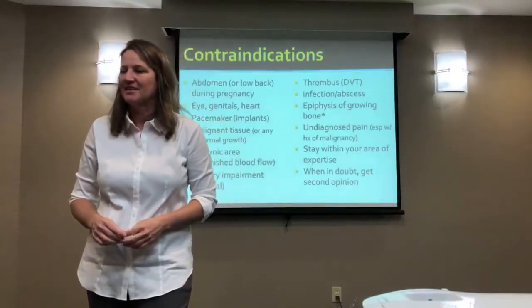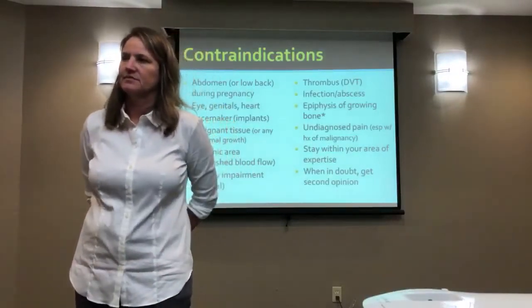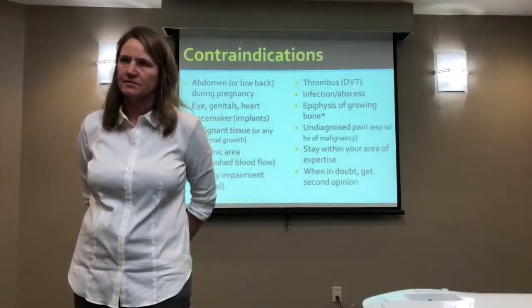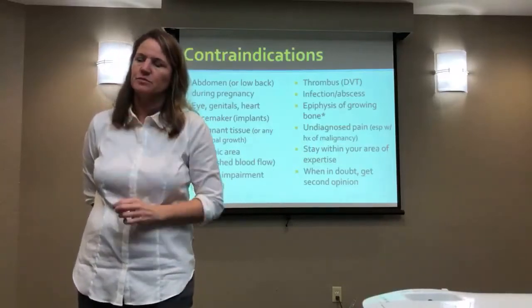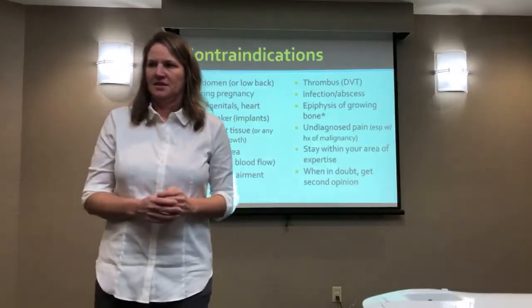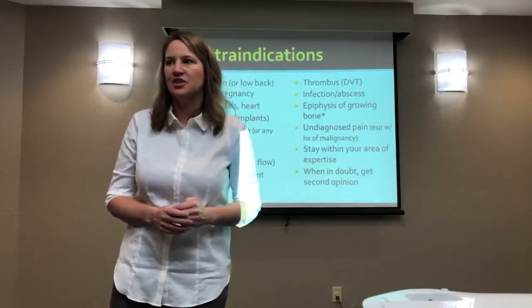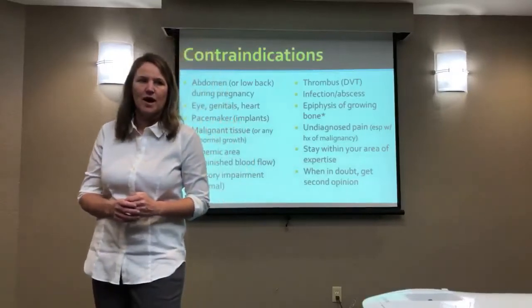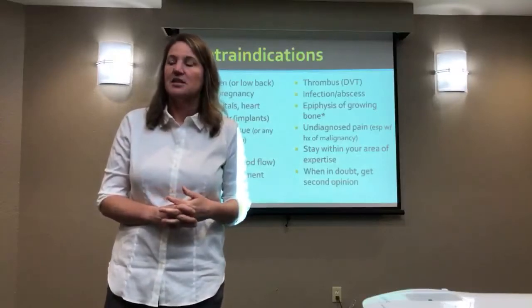I've had the opposite years ago. There was a doctor that I wanted to do ultrasound, and he said no. He was an orthopedic surgeon. He said that when he opens patients, it's like if you thaw chicken in the microwave, parts of it will cook. He finds cooked tissue, and he believes that it's from therapists jacking up the ultrasound and not moving it around. I can't imagine that that's happening, but wow. He didn't cite any references, but that was his personal reason for not ordering it.